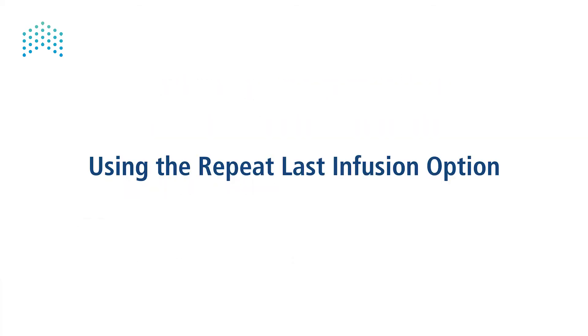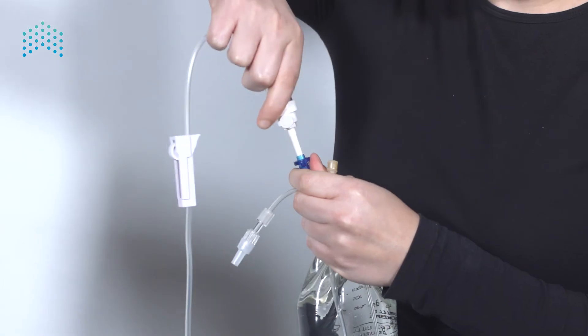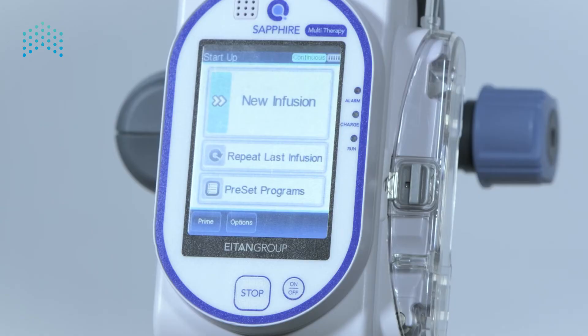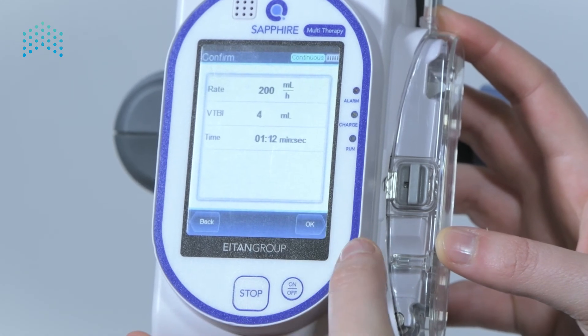The repeat last option: wait for the infusion to end. Connect the new medication reservoir and disconnect the patient and prime as needed. Select the repeat last infusion option from the startup screen. Confirm the program and start.